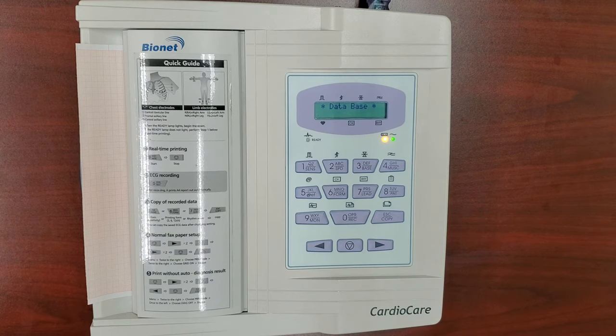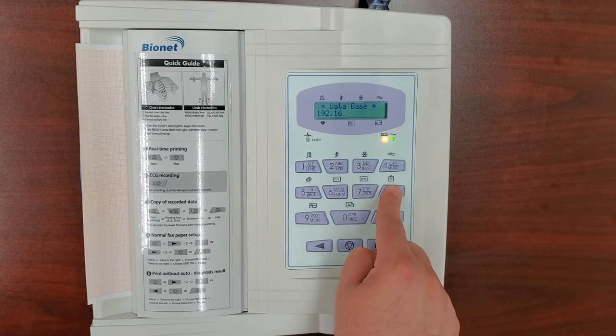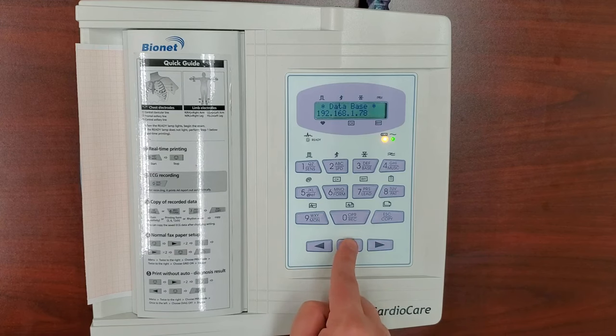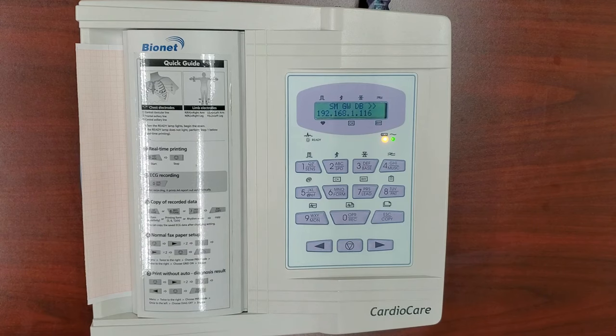Press the left arrow to the start to erase any data in this field and start fresh. Input the IP address from your computer, using the right arrow to place the dots within the sequence. Once the IP address is input, press the Menu button again to exit the field, and press the left arrow three times until it highlights IP. This number is your machine's IP address, and you will need to write it down for later.